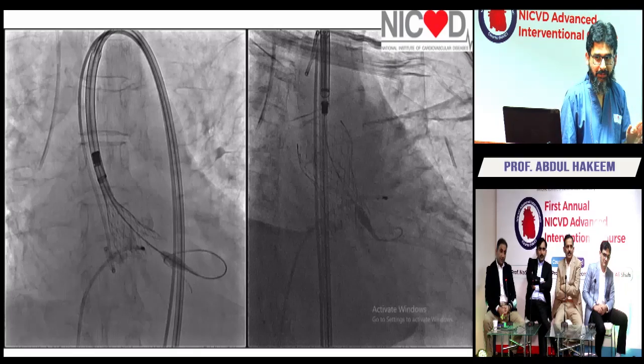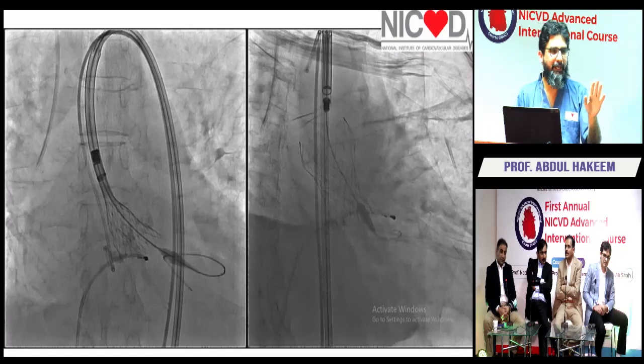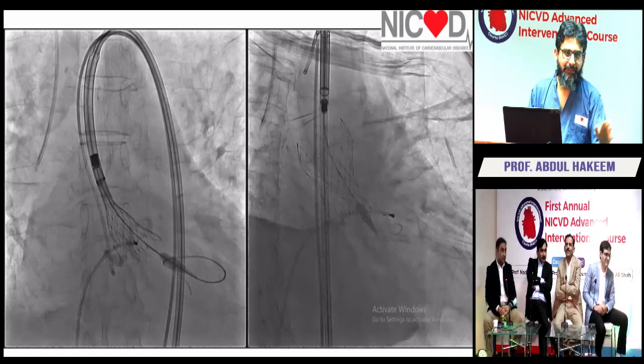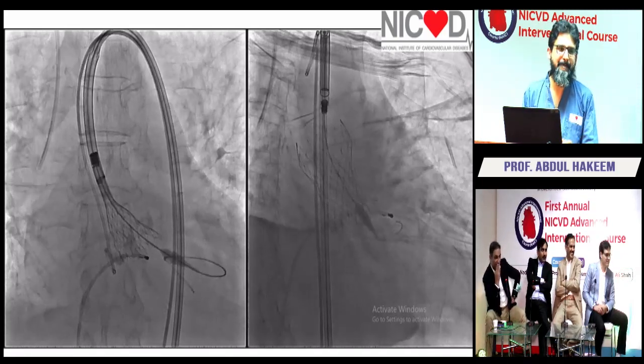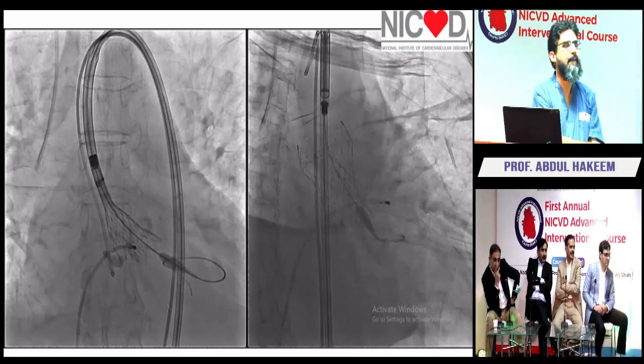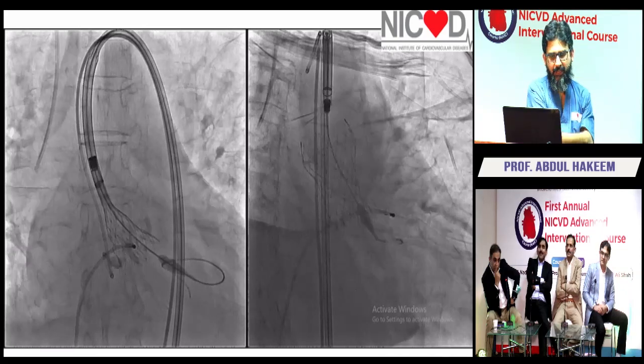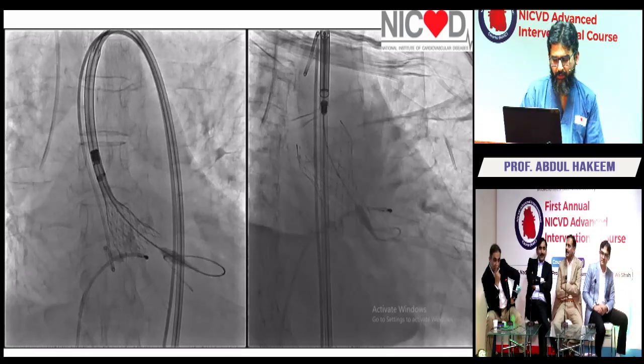Pull the wire out. I think always confirm. You know this case. Don't act smart. I am not speaking according to the case, just a general point. Always confirm the valve expansion in at least two views. Absolutely. Two views. So Dr. Kamran has made a very, very important comment here.